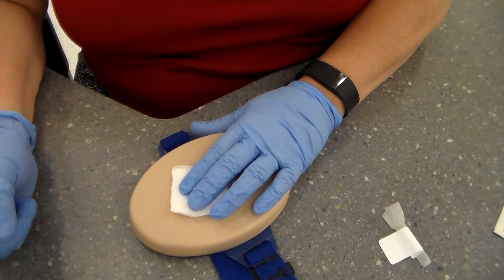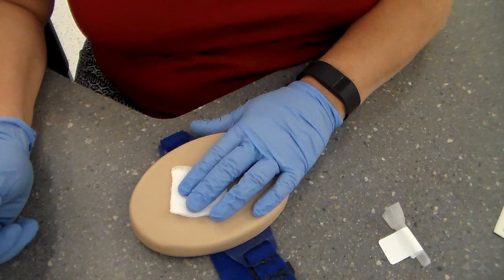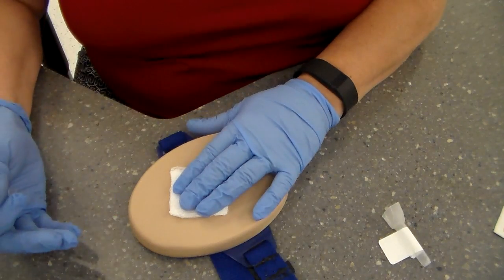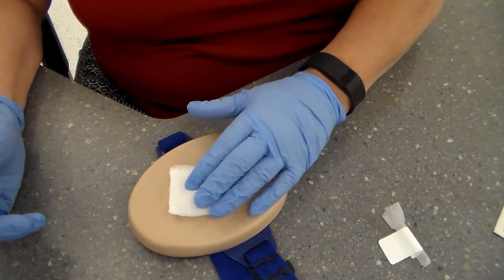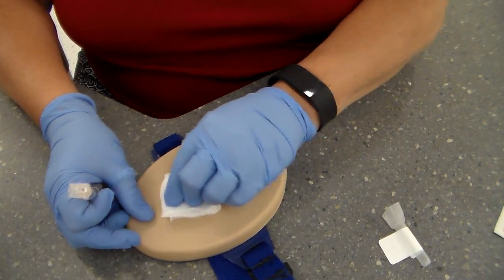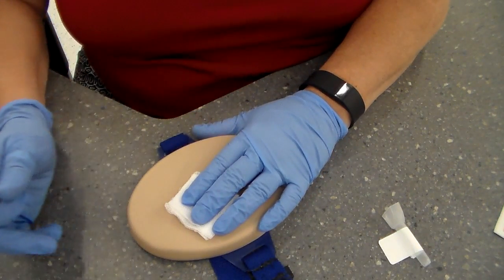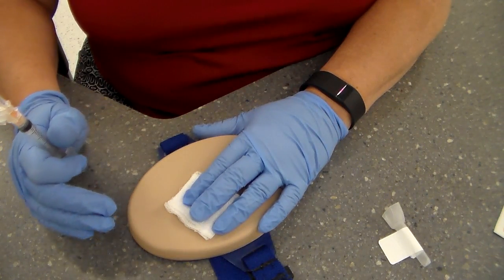Now, you can either put a gauze on the site or you can just leave it. Some of you may want to hold a gauze on that site, because liquid medicine may have seeped out of there. A little bit of blood may come up. So we just want to hold a gauze there. There's no rubbing. I don't want you rubbing. It's a nice gentle pressure on that site.